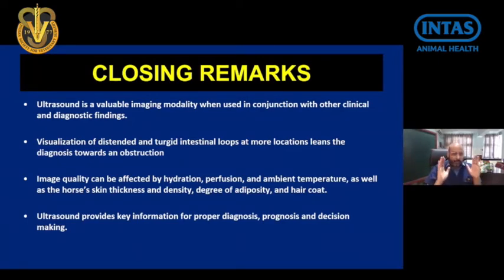Then of course, image quality can be affected by hydration, perfusion, and the ambient temperature also, as well as sometimes the horse's skin thickness. Its degree of adiposity also plays a role. And hair coat, if it is very, very thick, then also it is problematic. And ultrasound provides key information for the proper diagnosis, prognosis, and decision making while you are dealing with acute abdomen or abdominal emergencies or normal abdominal cases.